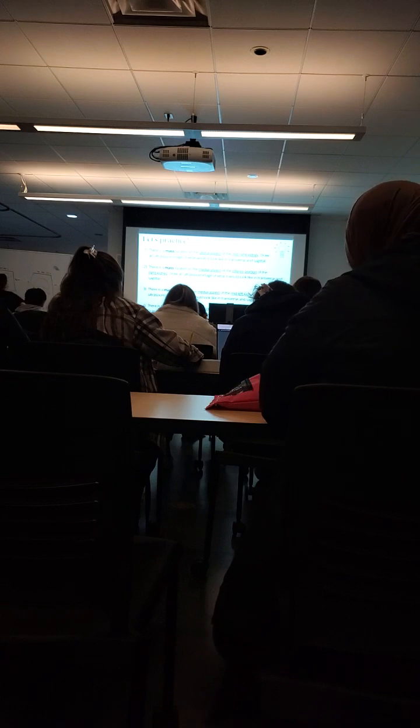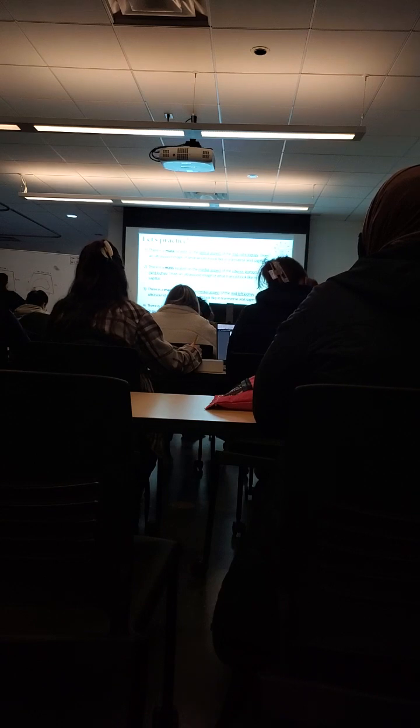So the trick here, even though it says mid-right kidney, we are not going to see anything unless it is lateral. I had to confuse you to make you understand. Because it's lateral, mid, medial, and the only way in Sag to get that lateral aspect would be to use the lateral image. Connor, way to go. And so, do we know if they said it was superior or inferior? No, so I guess we're just gonna put it right here.